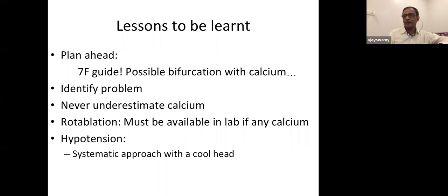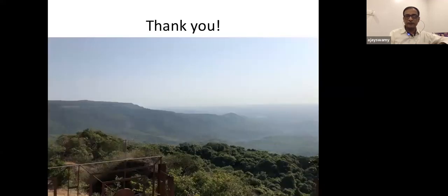You just look at what you've done with the coronaries, look at the heart, look at the pericardium, look for any retroperitoneal hematoma. If that doesn't occur, look at the IVC size. If it's small, then we're looking at a bleed somewhere else. Try and localize where the bleed is and try and close it off.